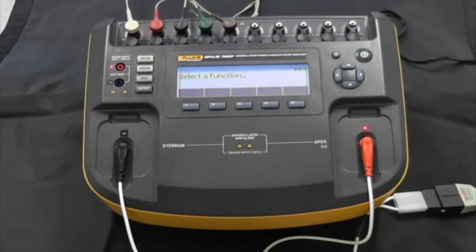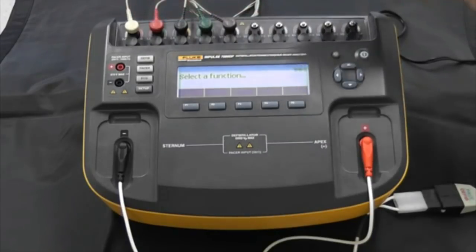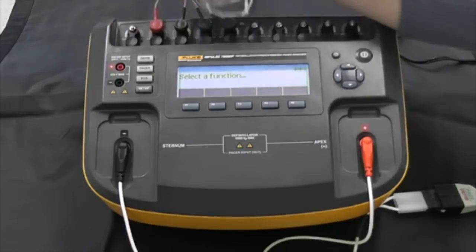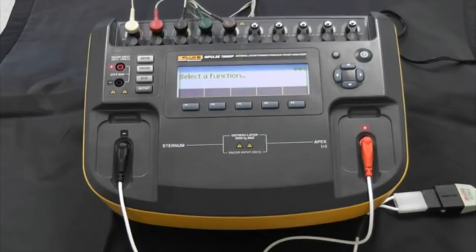The ECG connection posts up here are designed for up to 10 ECG leads, which gives us a 12-lead ECG signal. They're really secure and easy to connect your ECG lead wires to — no problem there.